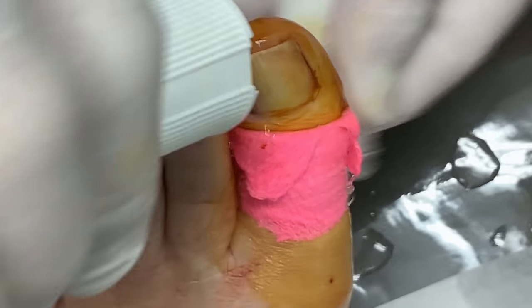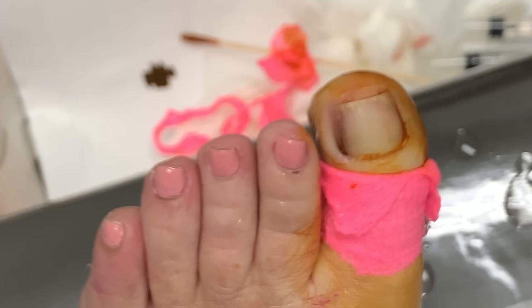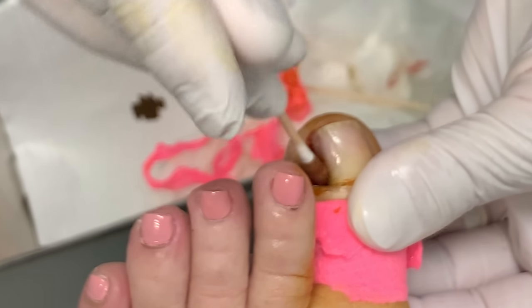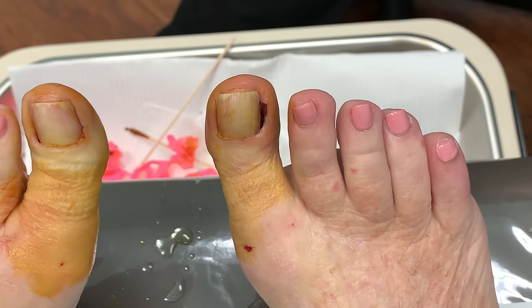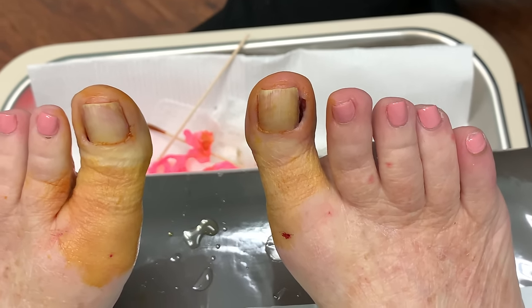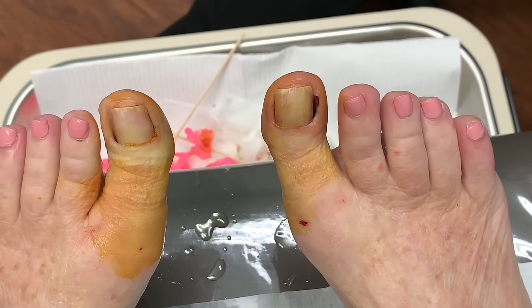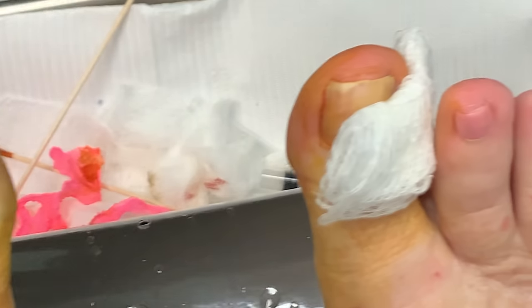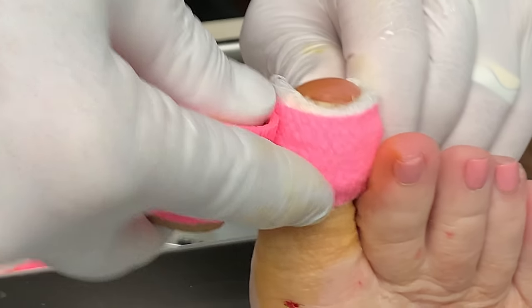This is nice and cauterized and it looks like we've killed the matrix there. Now we're going to flush it. Very cool. We're going to put some betadine on it just like the other one. Then I'm going to have you zoom out, Michelle. Look and see how it's not even really bleeding. That's because we have epinephrine in the shot, and we also had the chemical which cauterizes it and keeps it from bleeding afterwards. So let's go ahead and put this dressing on here — let's wrap it up. I like to put just the gauze with a little bit of CoFlex on here.